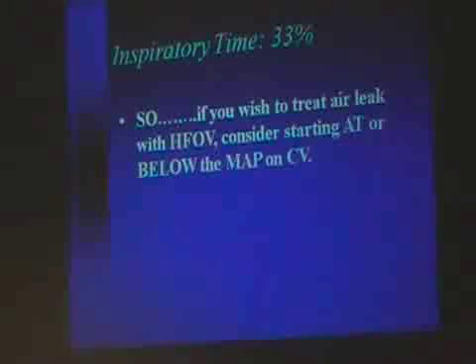That's what it does, because theoretically it will help you resolve some of the tearing of the interstitium from the PIE. But ideally, the jet, because of the way it works, is probably better for that. So with air leak, I think most people are using the jet. But if for some reason all you've got is an oscillator, and that actually happens in a lot of places, and it certainly happens in Europe, the jet is not available in Europe.